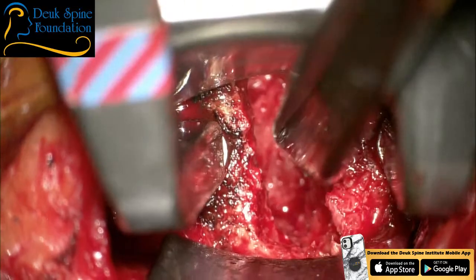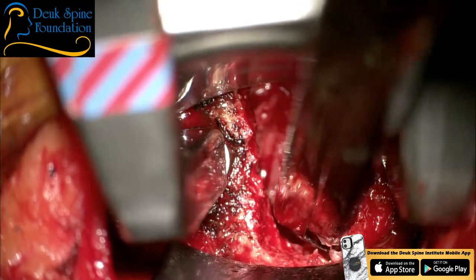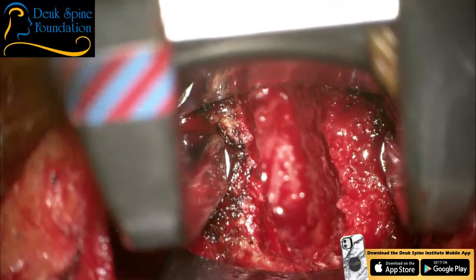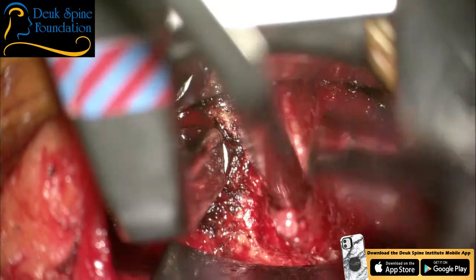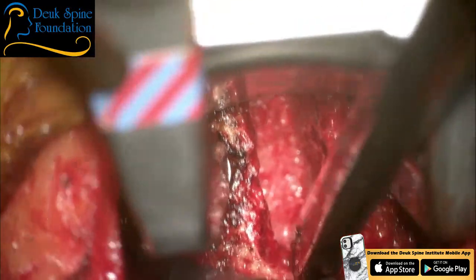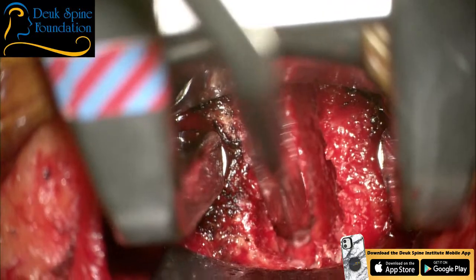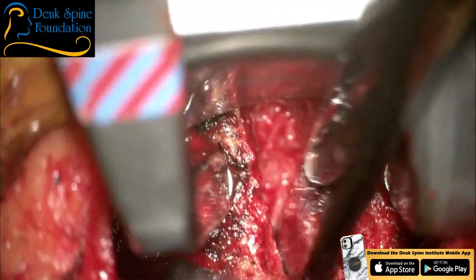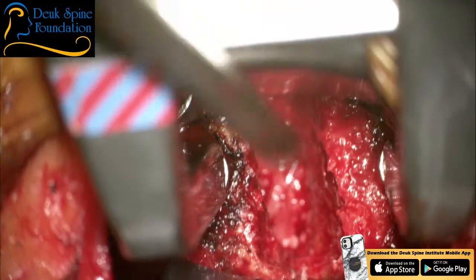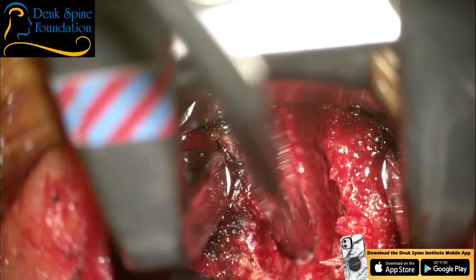I need to remove more of what's called the uncinate process, which is blocking me from opening that hole all the way. So I'm going to do that, but I can't really see it that well. So I have to take more of this lateral disc out. You see that bone down there? We're going to drill that away. That's the best way to do it. Okay, it's part of the uncinate process. See that, Dr. Patel? See how it's sloping up and back?